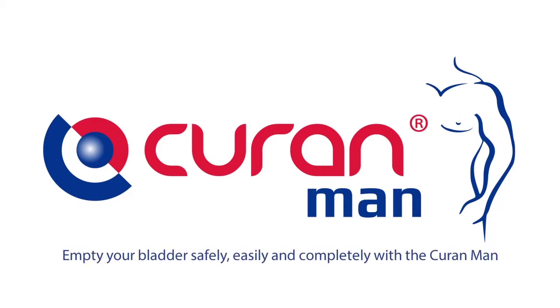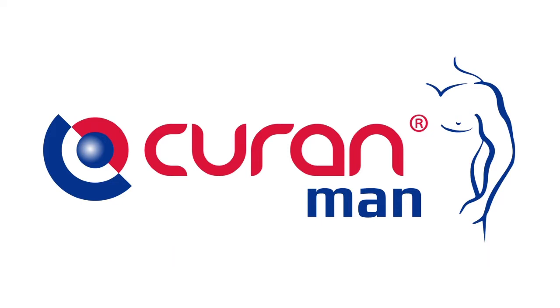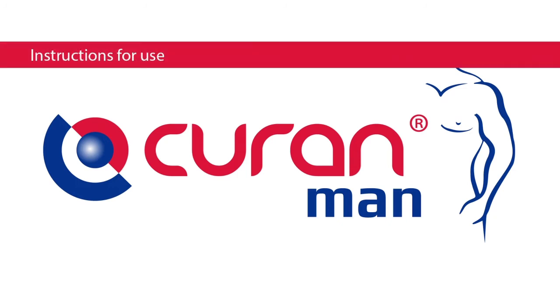This film shows you how to empty your bladder safely, easily and completely with the Curan Man compact ready-to-use male device. It is very important that the procedures for hygiene are followed thoroughly in order to prevent infections and guarantee a clean procedure.